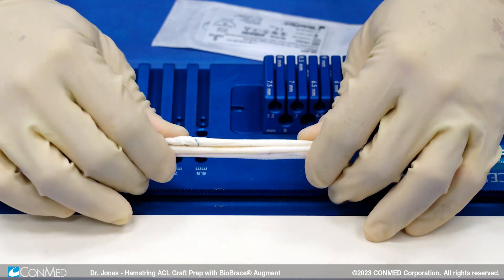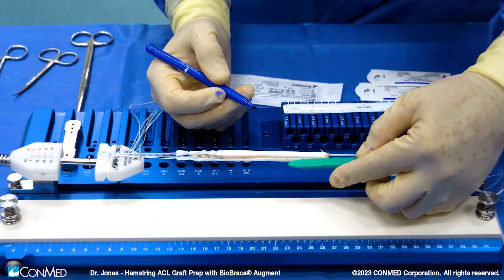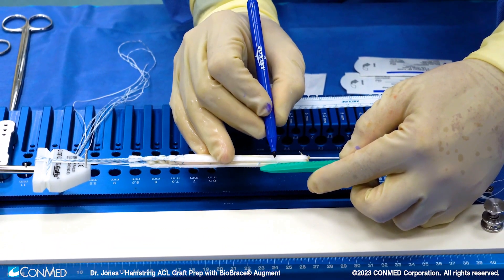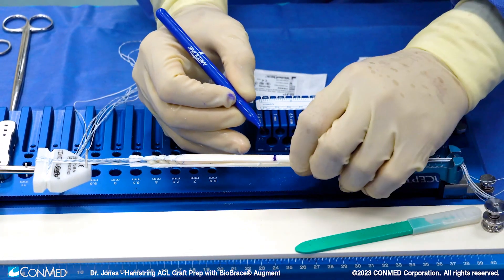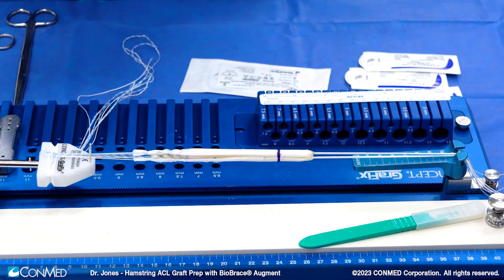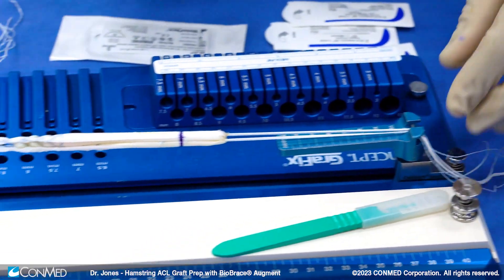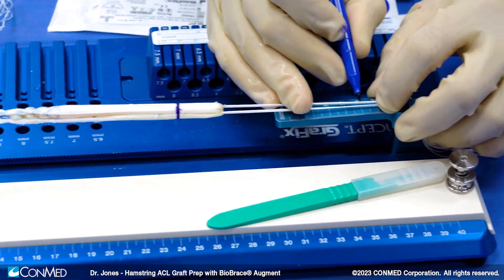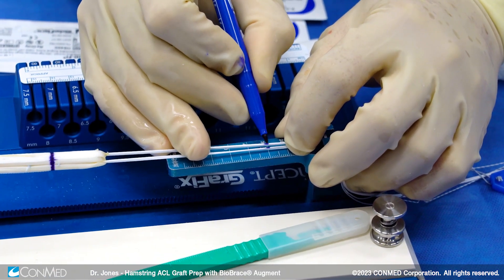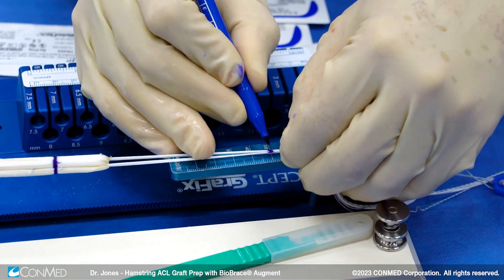That's the standard technique for preparation of the biobrace with either autograft or allograft. So once again, we drill our femoral tunnel to a diameter of 10 millimeters and a depth of 25 millimeters. I'm just marking the 25 millimeter mark for my graft — a nice demarcation that will tell us when we've passed 25 millimeters of graft into the femoral tunnel. Our cortical button went through at the 30 millimeter mark with our 3.5 millimeter spade tip, so we'll mark the looped suture with the button at the 30 millimeter mark, so we know precisely when we've passed the button far enough to flip it.